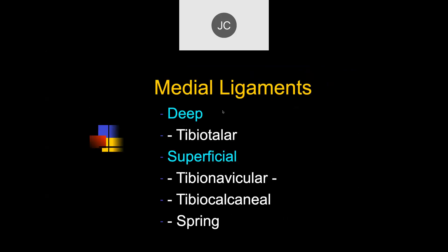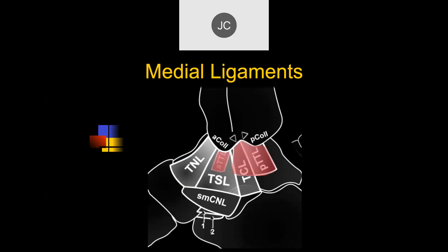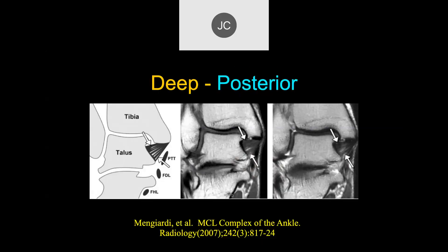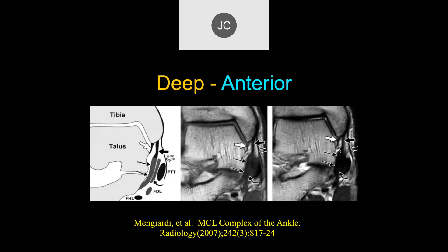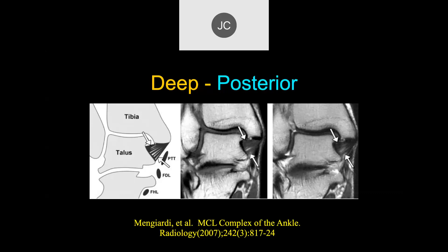Now let's talk about the medial ligaments. There's the deep tibial-talar ligament and the superficial tibial-navicular, tibial-calcaneal, and the spring ligaments. The deep ligament goes between the tibia and the talus and has a typical striated appearance — this is called the deep deltoid ligament. If you lose these striations, that typically indicates you've had a prior injury that healed with scarring. Not all that significant, but that's typically what it means.